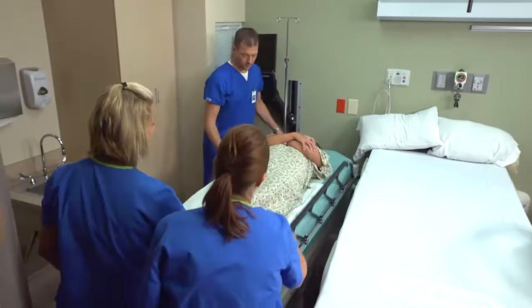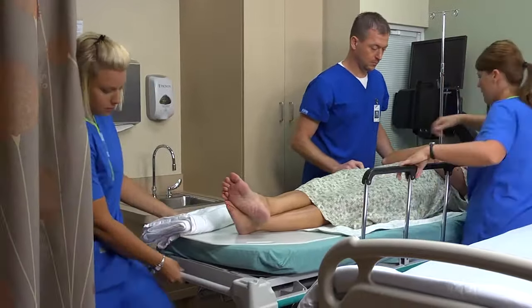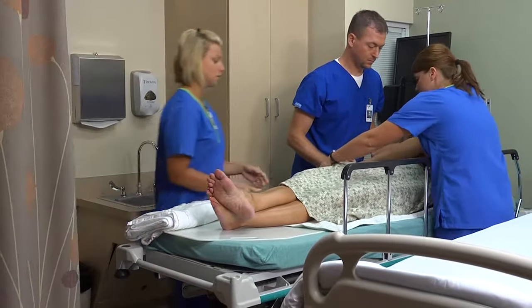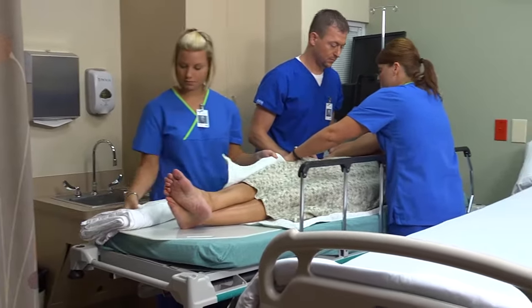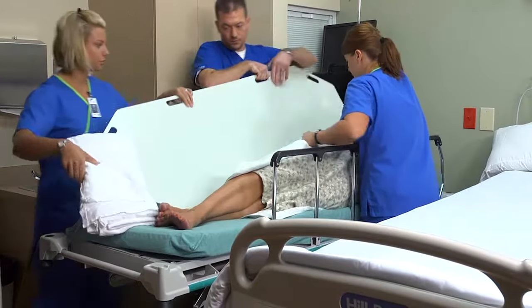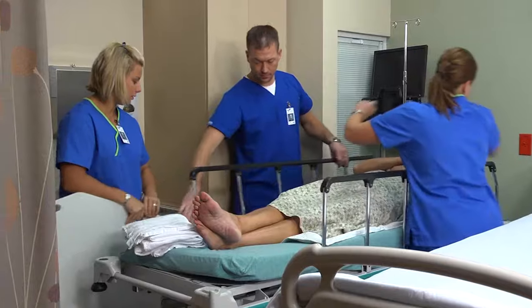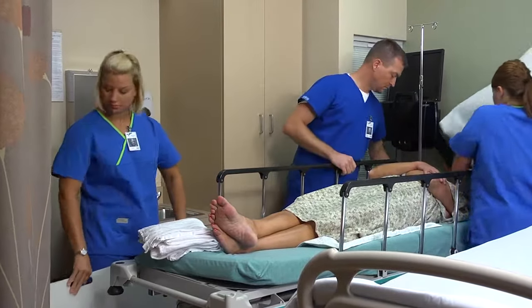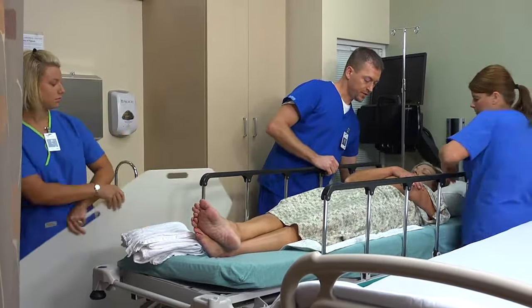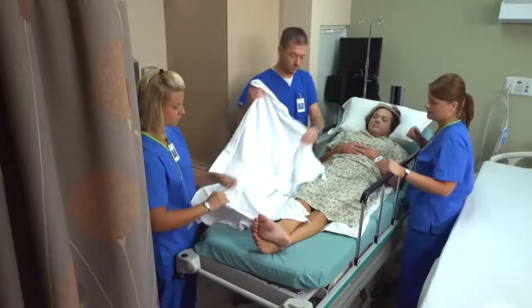Position the patient in the center of the stretcher, then on the count of three, pull her over and remove the slide board from underneath her — one, two, three. Raise the side rails on the stretcher. Raise the head of the stretcher if not contraindicated and cover the patient with a blanket.